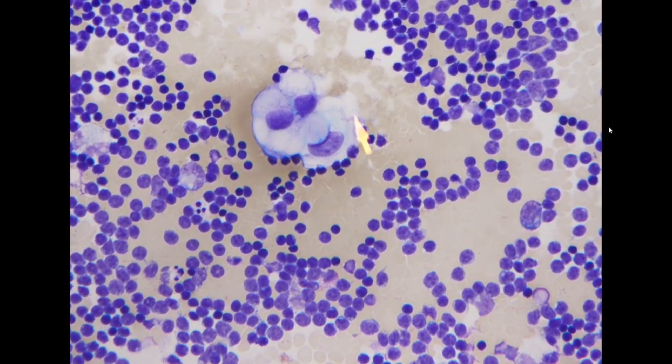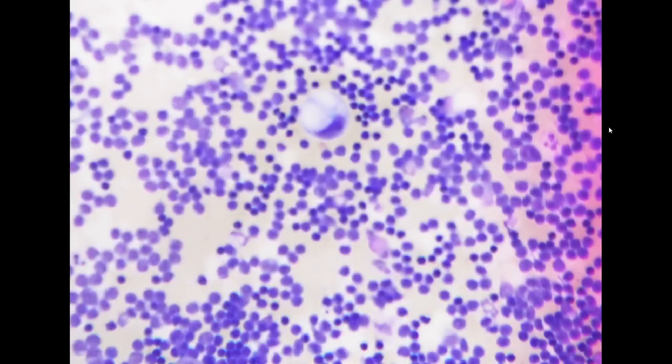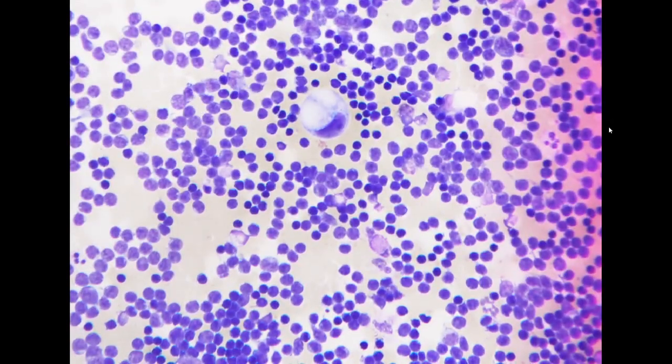So this is suspicious for adenocarcinoma. There is a cell block, but we didn't see any atypical cells there. So overall, I think it is suspicious, but not definite for adenocarcinoma.